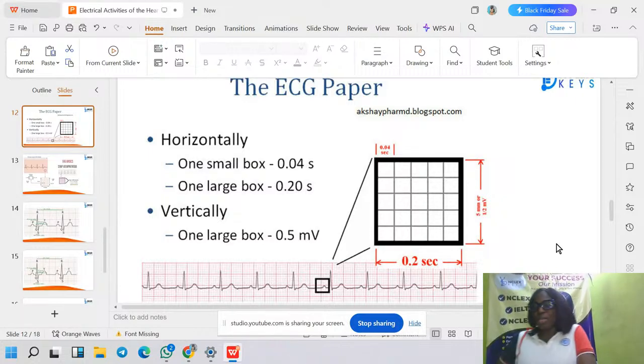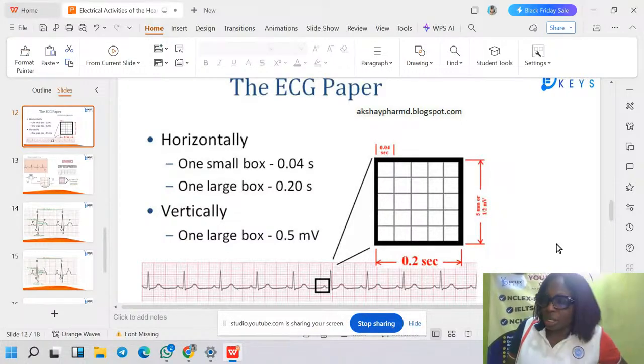I've shown us when you have 30 boxes and when you have 50 boxes. Don't count the whole number of R's in 50 boxes, or you will miss the question. Remove your 30 boxes, count how many R's are in that 30, and look for the closest option to it. Our time is fast spent, but I will finish this.